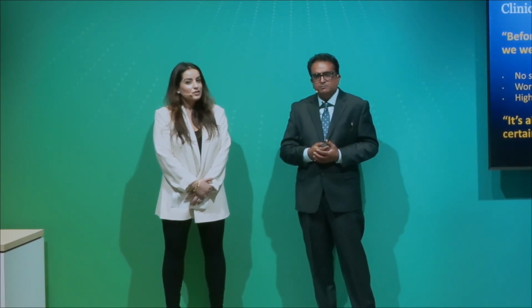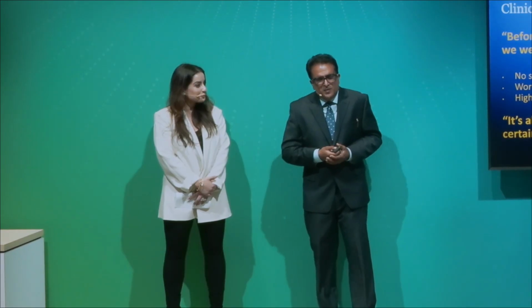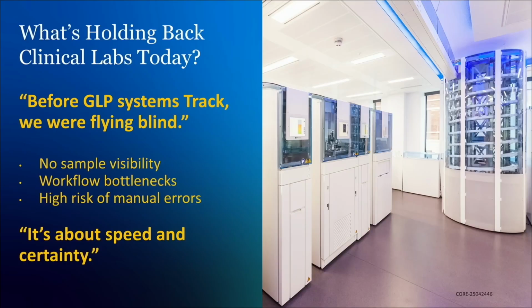So where do you think holds back the clinical lab today? There's a lot of factors. One of the biggest problems we were facing with the previous generation and other situations is, where is the tube? It's the biggest question that comes up. So we used to spin our troponins offline. And you had to, because the previous track system treated every sample as the same.